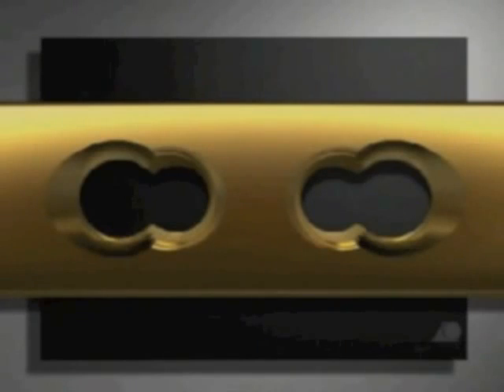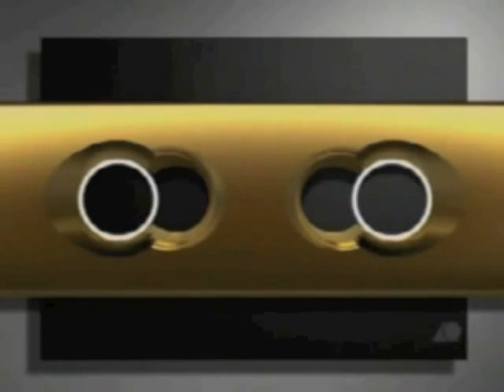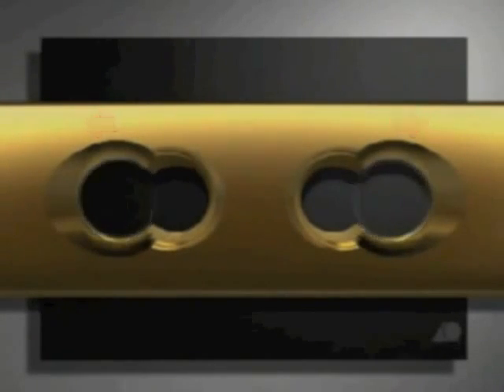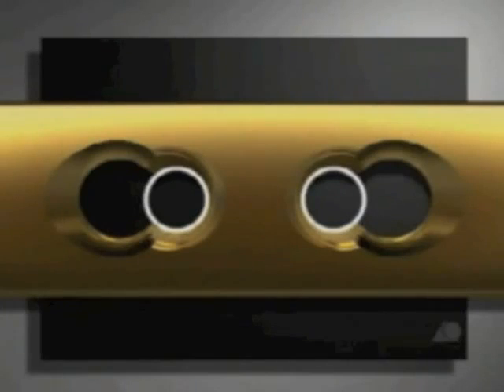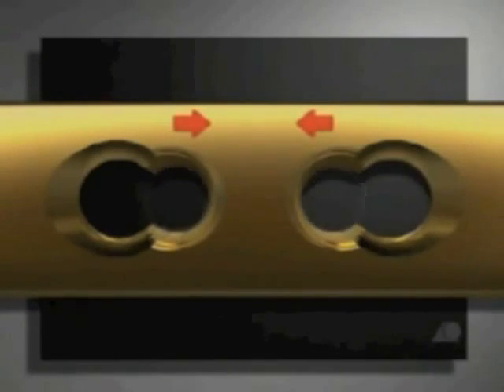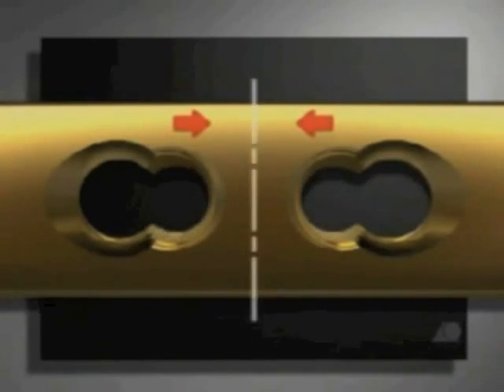The threadless part of the combination hole always faces towards the end of the plate. The space between the two inner combination holes, whose thread portions face each other, represents the center or middle of the plate.